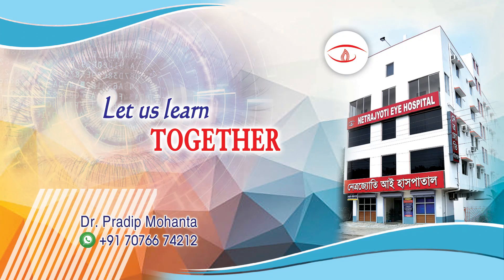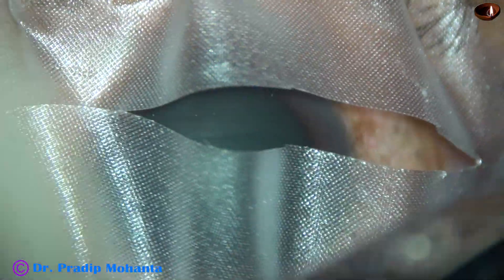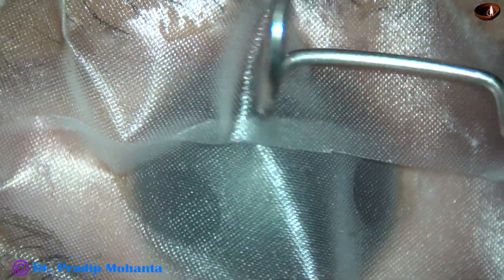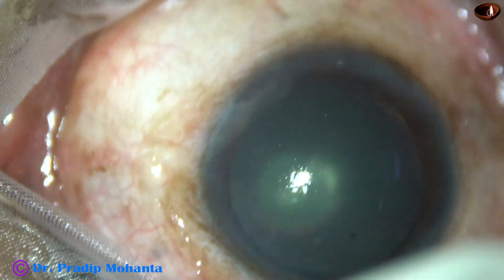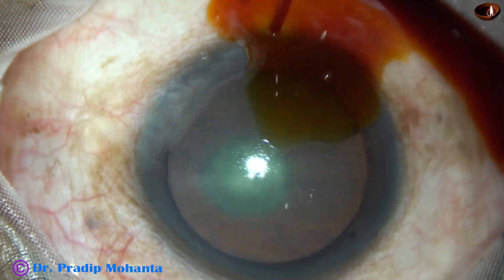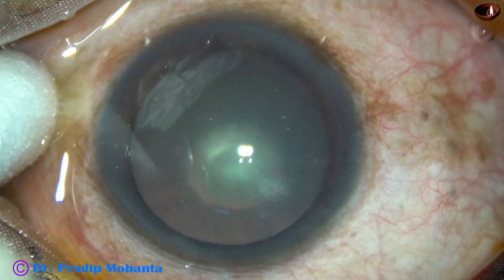Friends, welcome to my workplace at Ranaghat, West Bengal, India. Draping is very important — do the draping very nicely. And while you apply the speculum, make sure that the lid margins are nicely covered. When the instruments go in and come out, they should not come in contact with the lid margin. Apply a few drops of povidone iodine and irrigate the ocular surface thoroughly.